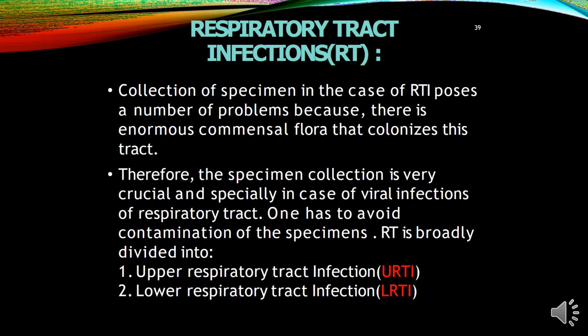Next is respiratory tract infection. Collecting samples in case of respiratory tract infection poses a number of problems because there is enormous commensal flora that colonizes the respiratory tract. Therefore, specimen collection is very crucial and special cases of viral infection of the respiratory tract should be taken note of. One has to avoid contamination of the sample.